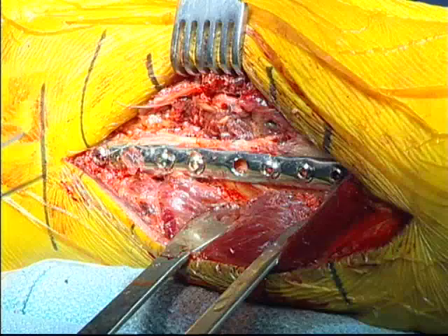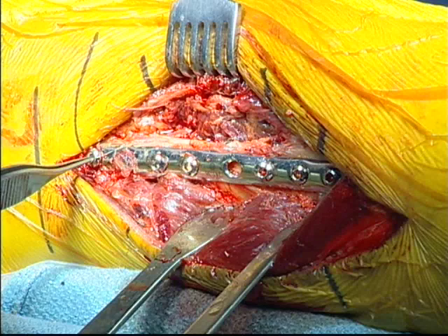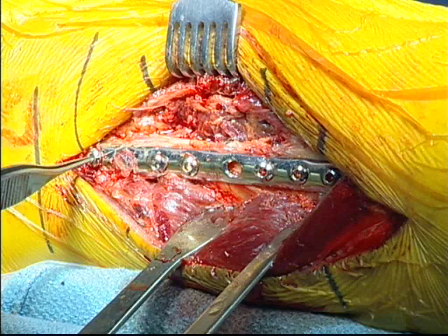Here's the final construct: two intrafragmentary screws, an eight-hole one-third tubular plate, six cortices above and six cortices below the fracture with a metal screw, and then one bioabsorbable syndesmosis screw with a portion of the head removed.